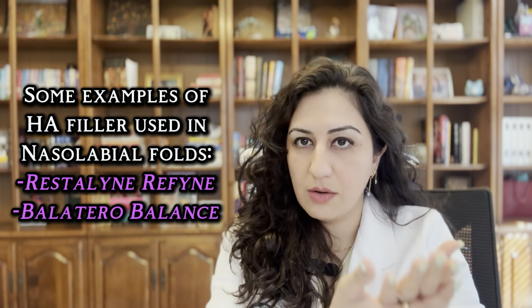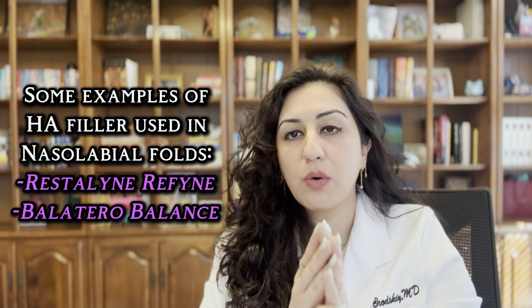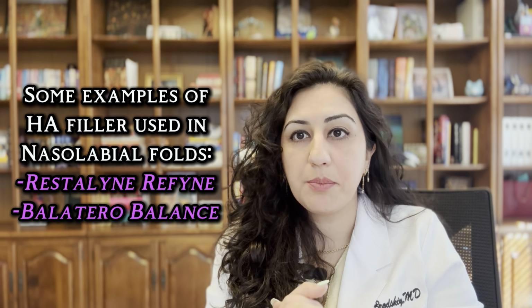Now, obviously, if it's a very deep fold and it's visible to the eye that it is a result of aging, yes, you can inject it to protrude it forwards a little bit to decrease that appearance. But remember, to have the fold is normal, and if you completely get rid of it, if you take a look at the patient at 180 degrees across, right, they're going to look funny. Okay, so just be mindful of that.